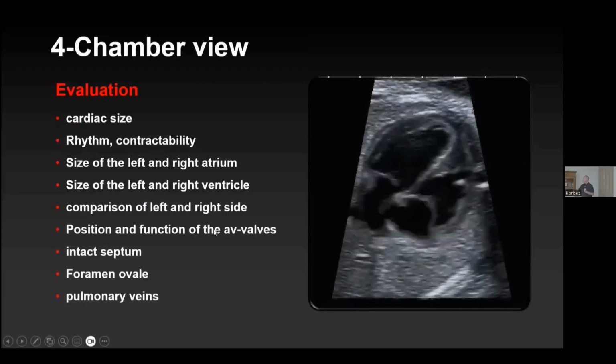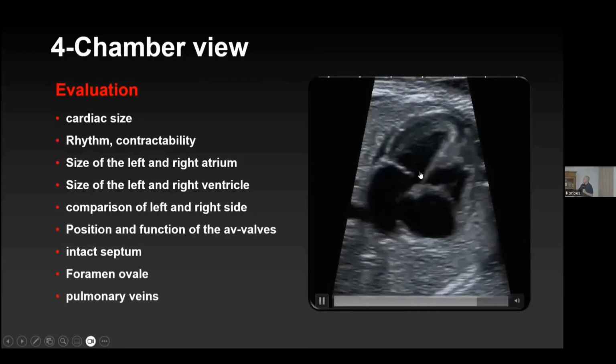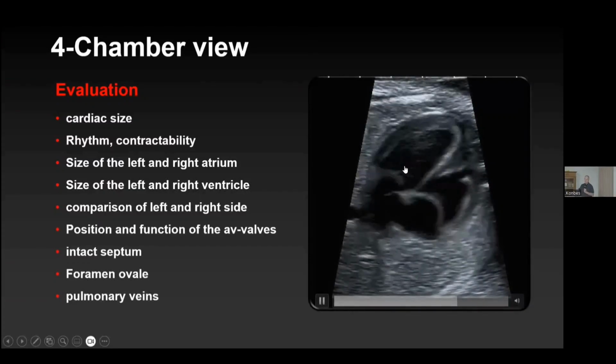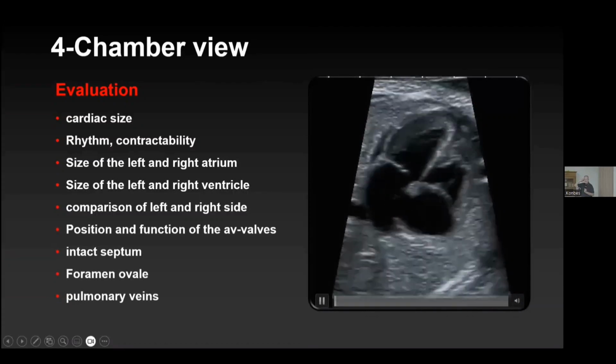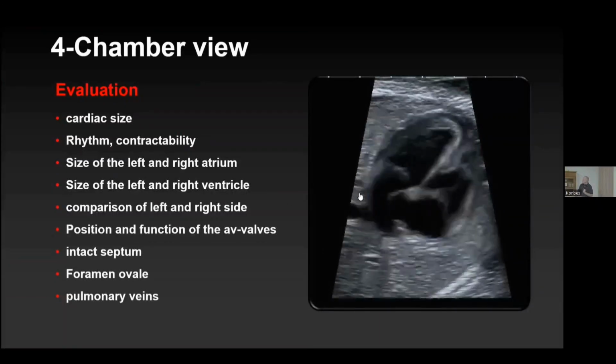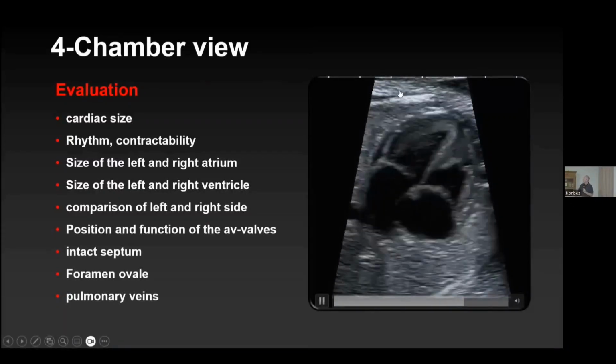So we make a test. What is this here? Left or right side? Left side, that's right. And it's easy to detect. It's cut a little bit here, but we see the aorta, and this is the left side.